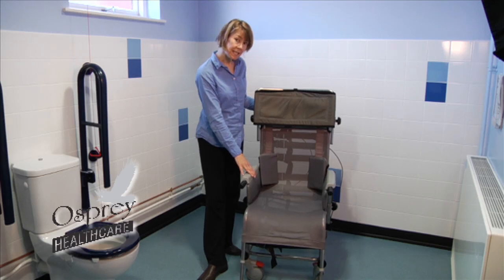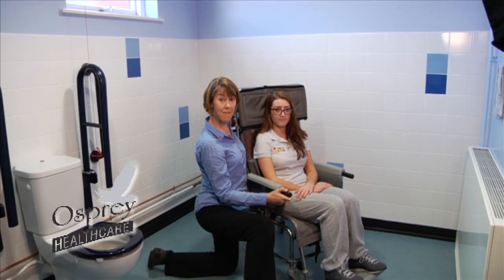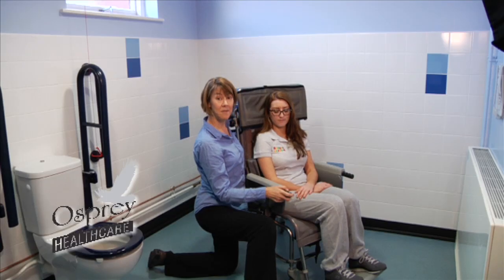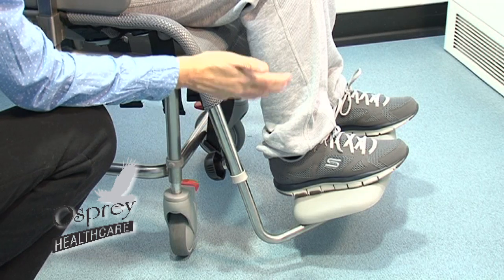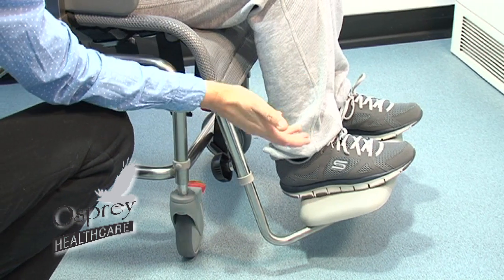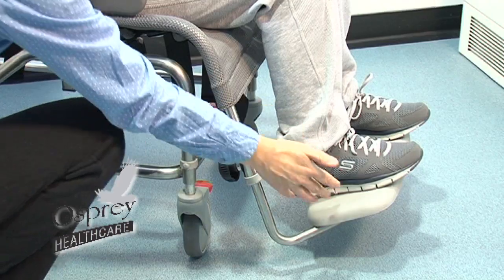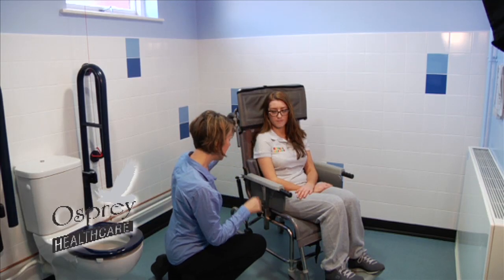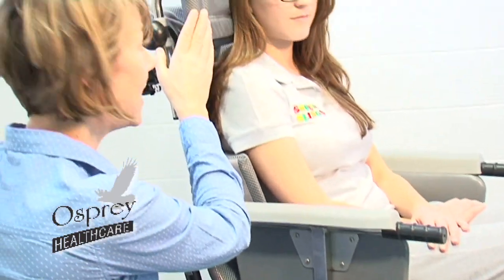We'll now put somebody in it and have a look at the tilt-in-space mechanism. We have Emily in the shower cradle now and we've set it up for her. It's important that we set the footrest to the correct height to support the person's feet, because that keeps the person's bottom back in the chair and makes it a lot more comfortable. The armrests are height adjustable as well, and so too is the headrest.